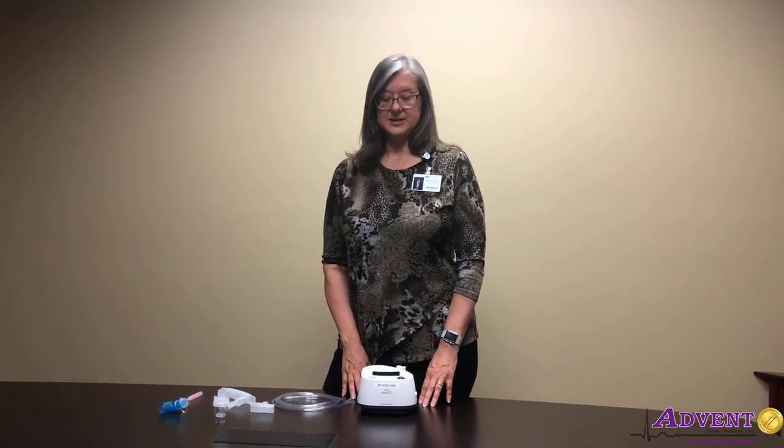Welcome to Add That Home Medical eLearning. I'm Kelly, one of the respiratory therapists here at Add That Home Medical. Today we're going to talk about the nebulizer.